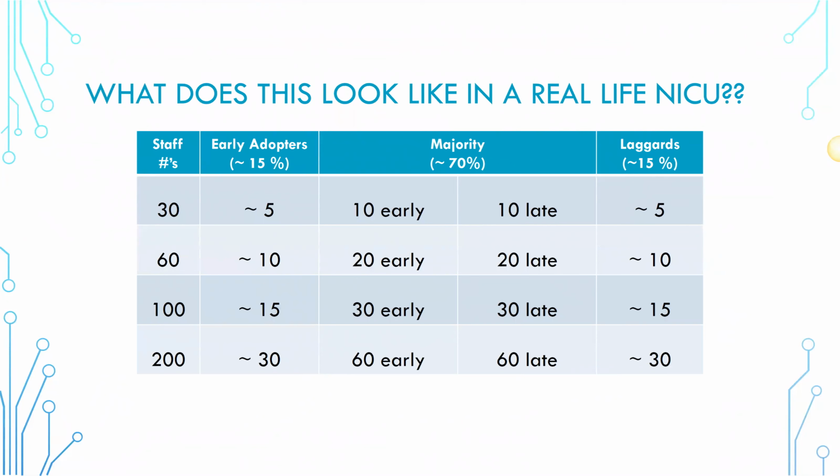So how many aEEG machines would you recommend for a 30-bed unit? I think in an ideal world, and again, I do not work for any device company, so let me just say that, I think probably ideally one for every 10 beds, for a busy NICU.